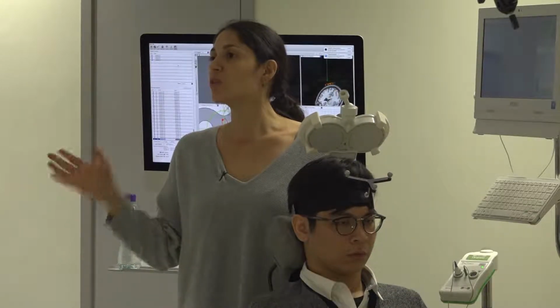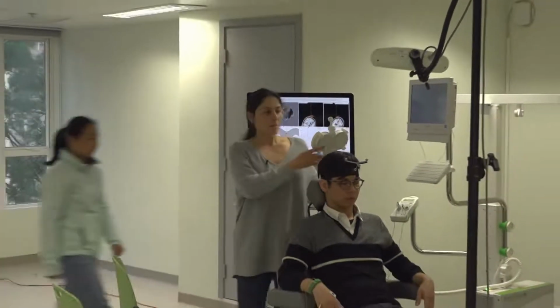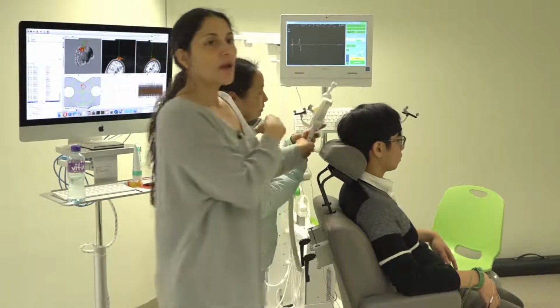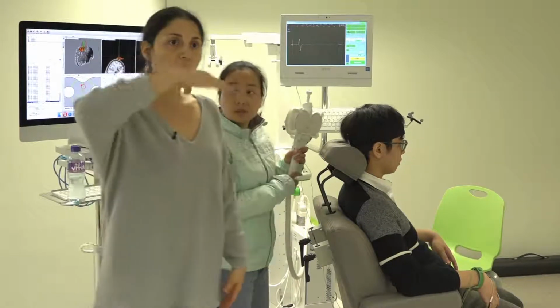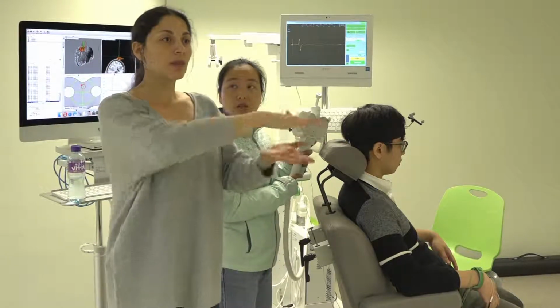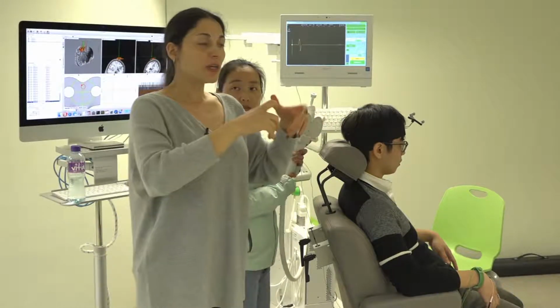This is the first part. Once you have the spot, from there you continue. She is too low. And in her case, what I will do, I prefer always to be high, maybe because I'm used to working high. The person is lying down, and I can see perfectly the head. So it's easier for me.